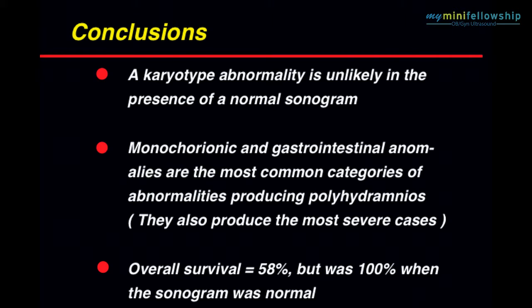The overall survival in our study cohort was only 58%, but it was 100% when the sonogram is normal. So, in my opinion, this is one of the greatest strengths of sonography. If the sonogram in a case of polyhydramnios is normal, it remarkably changes the prognosis for the pregnancy. This is extremely valuable. Thank you very much.